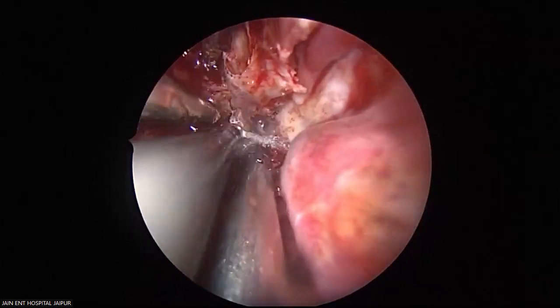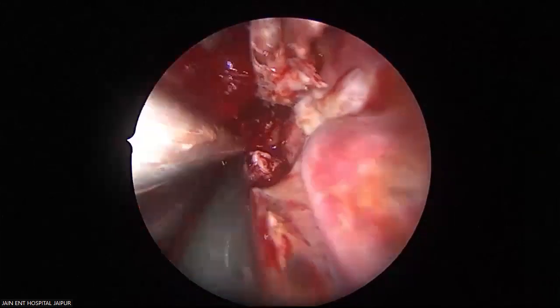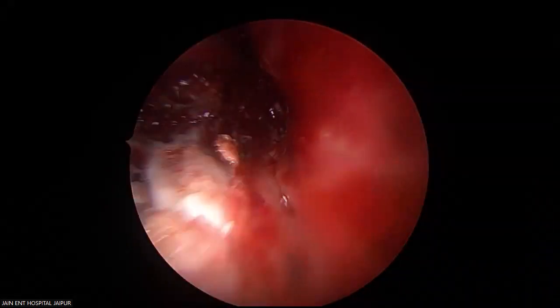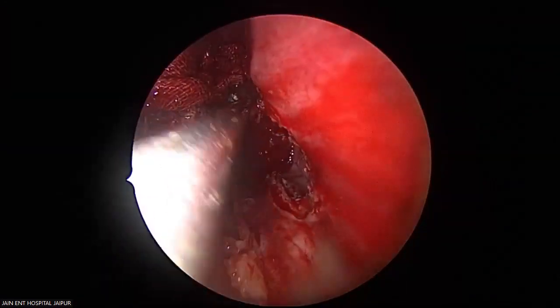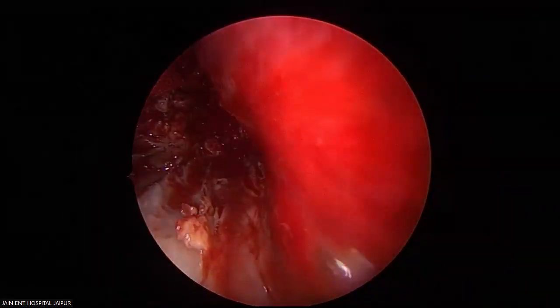An assistant role is very important. He pushes the tumor, so the plane will be free. See, it clearly is seen. Yes, sir. I can remove even through the oral cavity, nasal cavity also, not very big one. Give me the forceps. Now clean section.